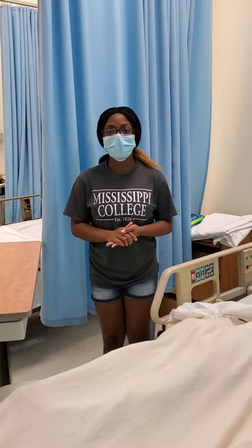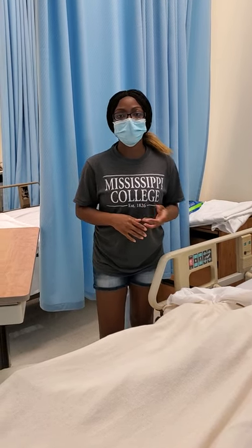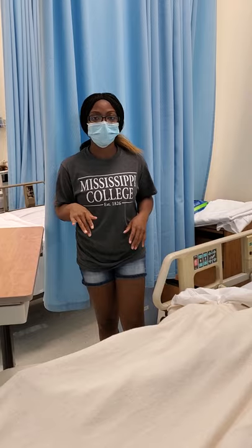Alright, today I'm going to be inserting a Foley catheter. The first thing that I'm going to do is review the physician's order, and it says to insert a Foley catheter. Now I'm going to go into my patient's room. I'm going to knock on the door, provide privacy. Now I'm going to perform hand hygiene, and now I'm going to introduce myself.